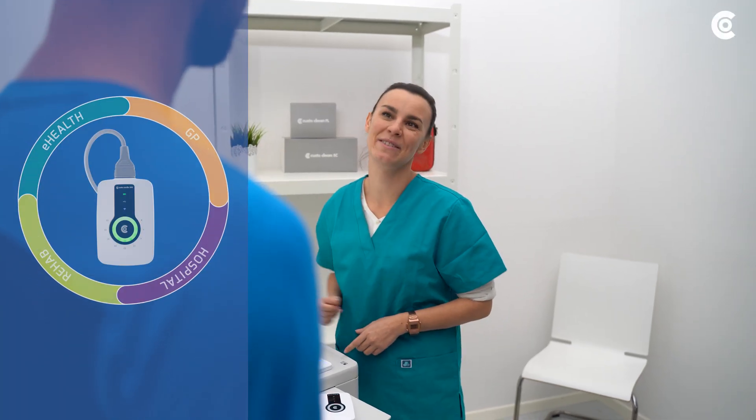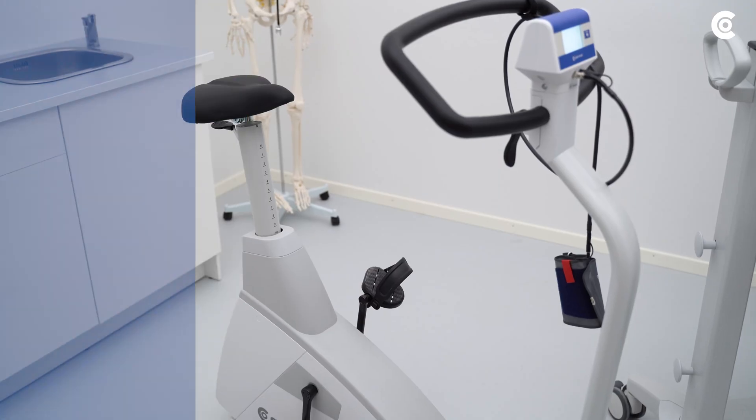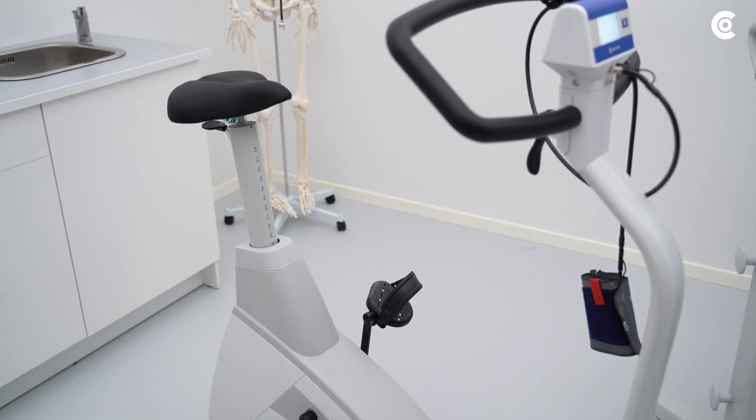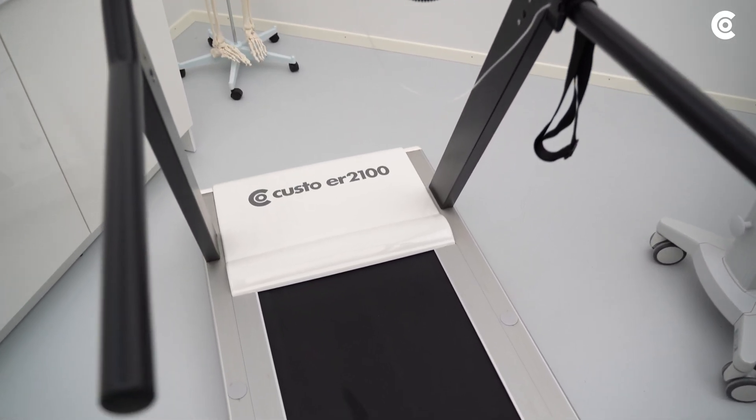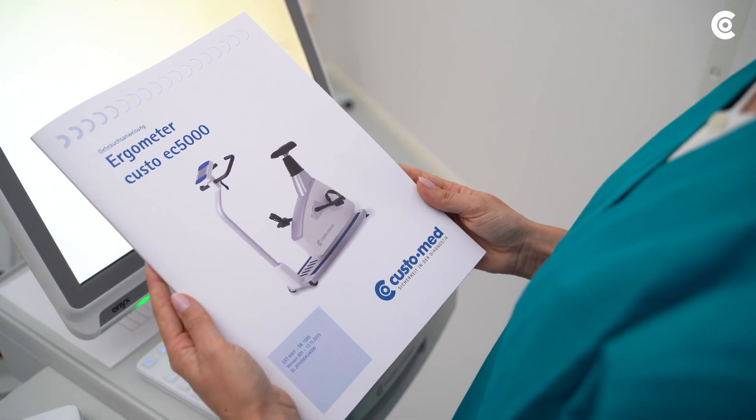In the following video, I will explain the procedure of a stress ECG with Custo Cardio 300 on an ergometer and a treadmill. Please take note of the manufacturer's instructions for safe use of the treadmill or ergometer.